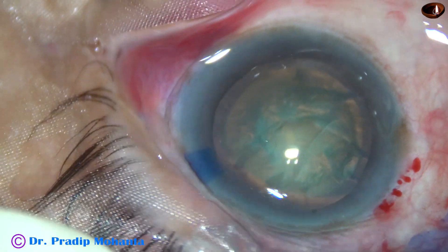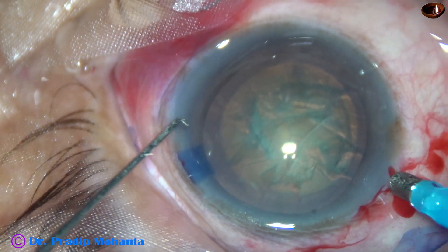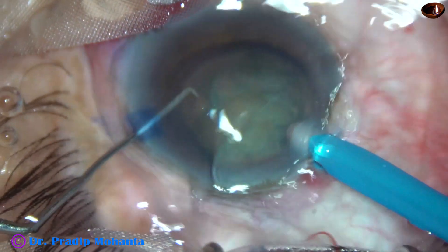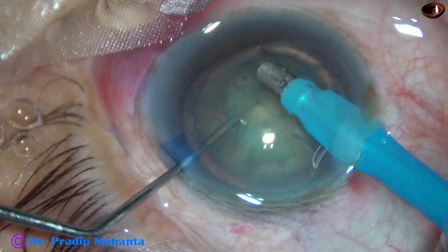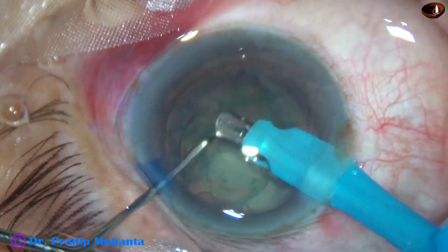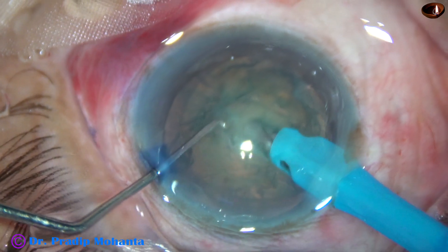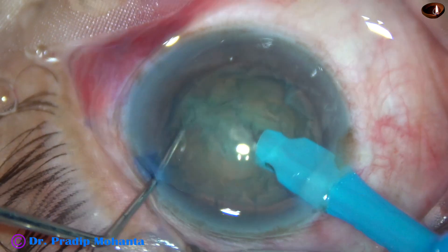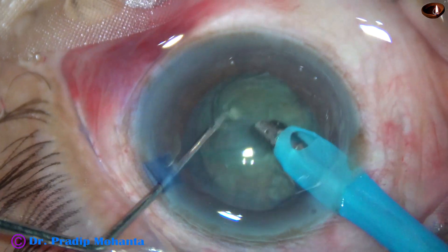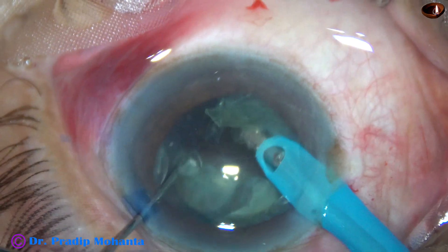And here goes the FACO needle into the anterior chamber, bevel down. I usually divide the nucleus with bevel up, but here I am trying to do it bevel down. This is submarine chop with bevel-down position of the FACO needle. And this is chopping of the nuclear fragment with bevel sideways.